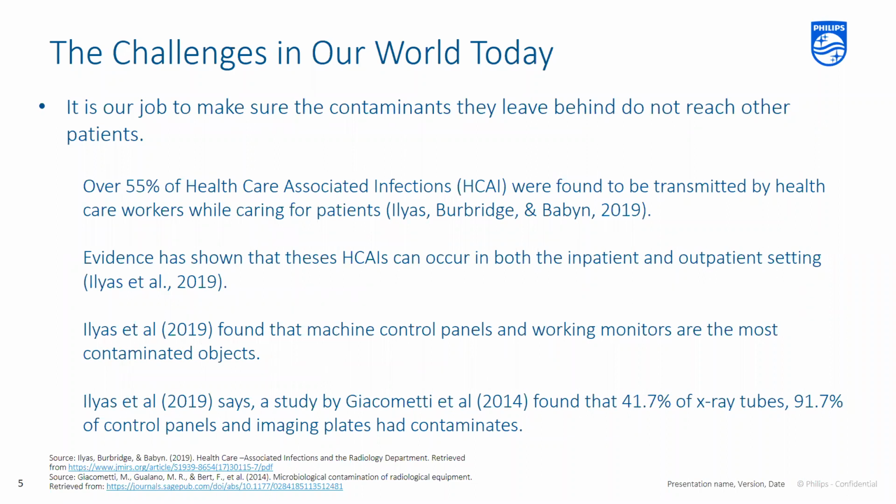The challenges in our world today, it's our job to make sure that the contaminants that we leave behind don't reach other patients. Evidence here has shown that HCAI can occur in both the inpatient and outpatient settings. Found at the machine control panels, workstation monitors are the most contaminated objects in the radiology department.